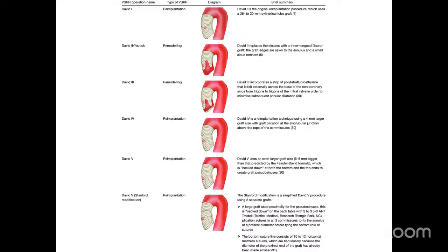David 4 is a reimplantation technique using a 4 millimeter larger graft size with the graft plication at the sinotubular junction above the tops of the commissures.